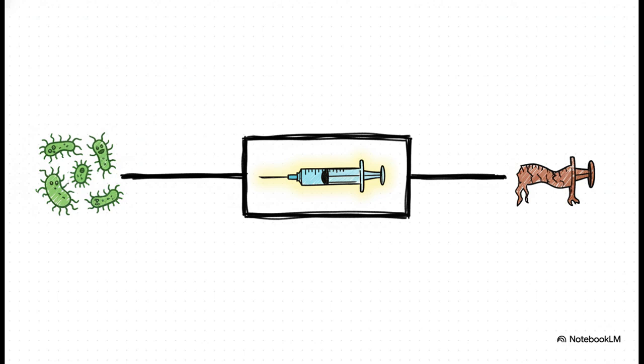Once that's all established, you are forced to operate within what we call the dose window, and it is a very delicate balancing act. Look at the left side. If any part of your product drops below that minimum dose, it simply isn't sterile. You failed to hit your 10 to the minus 6. But on the right, if you exceed the maximum dose, well, your polymers might embrittle, crosslink, or discolor. You're left with a perfectly sterile product that is functionally ruined. So you must stay inside that window.